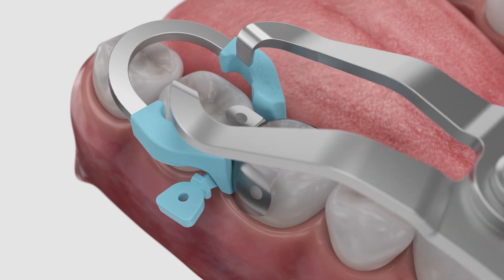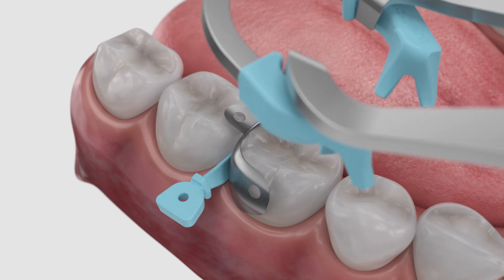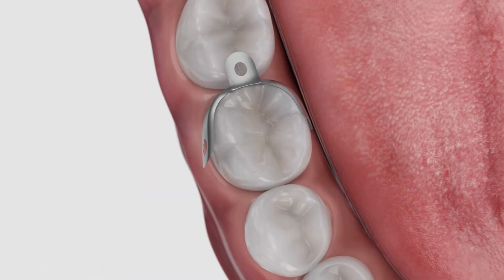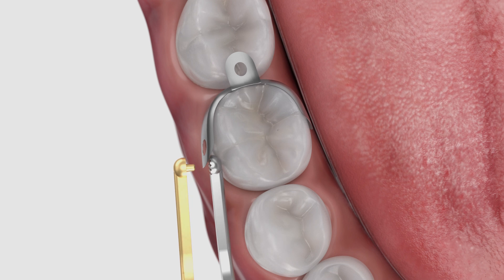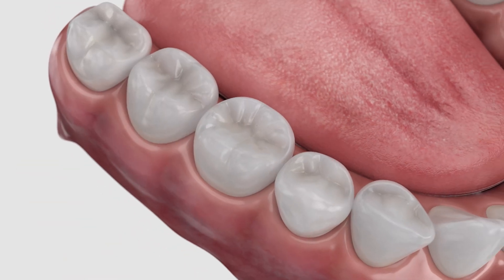After the restoration has been properly placed and cured, remove the ring using forceps and wedge using pin tweezers. Use pin tweezers to grab the matrix wing hole and remove. Polish to completion.